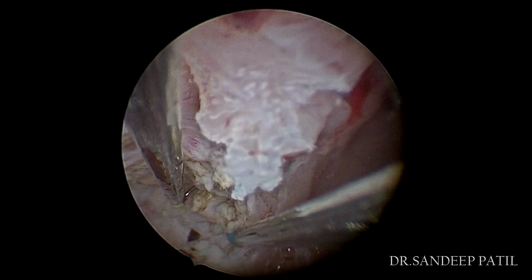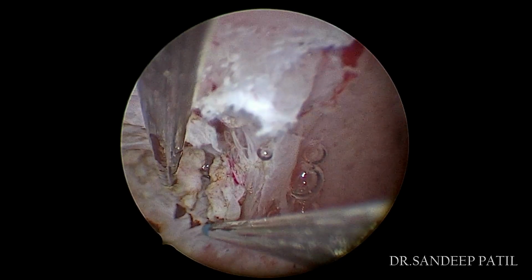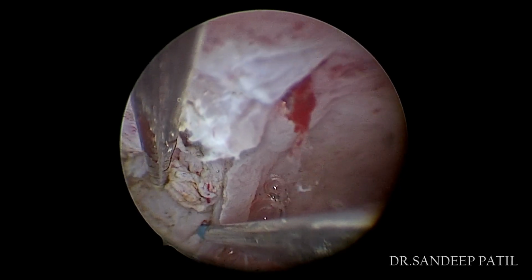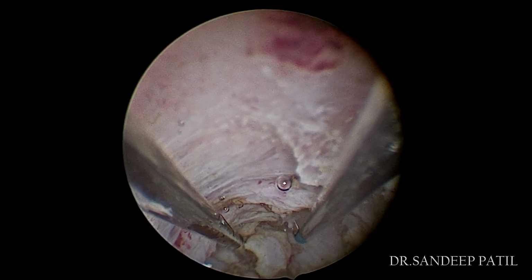The intramural part of the fibroid is a bit difficult to resect as compared to FIGO 0, 1 or 2 fibroids. We literally need to dig into the fibroid and do resection. This digging should not be too deep. We need to resect the fibroid in very thin strips to avoid perforation.